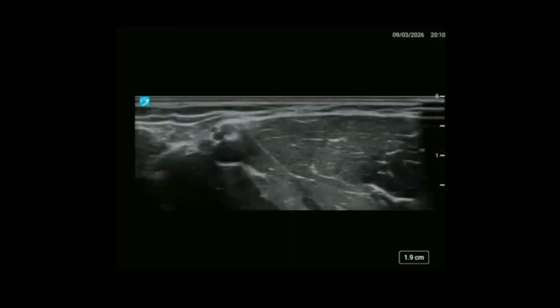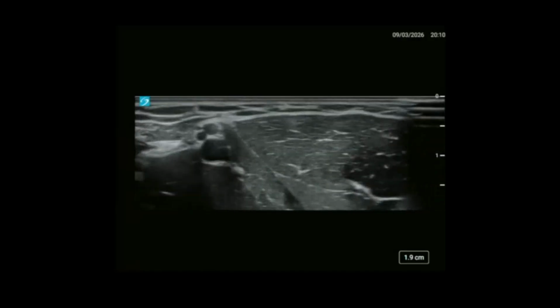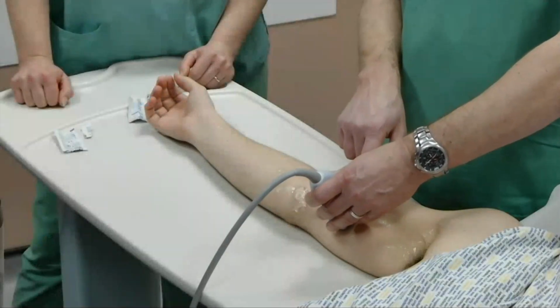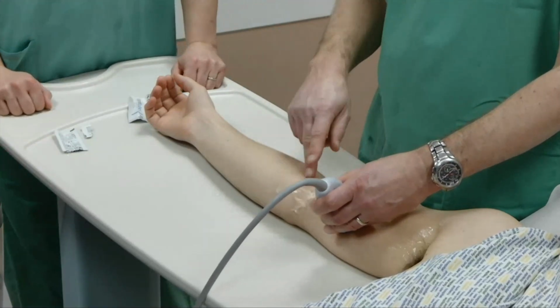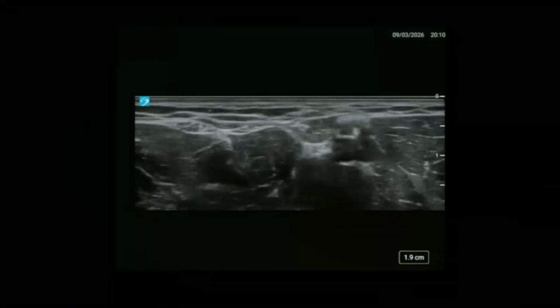Because I'm stood lateral, I want to block it proximal to here so that I can get my needle around the nerve safely. So I am roughly in the distal third of the arm at this point, but it will vary, because that split over to the other side can happen at any point, and it might be that it happens much nearer the axilla.